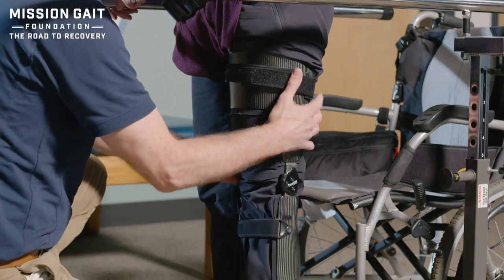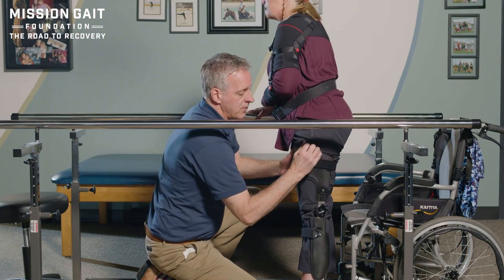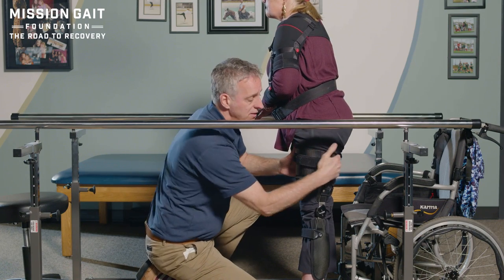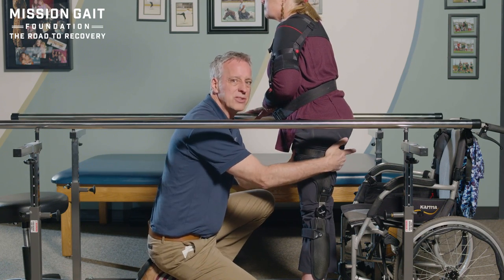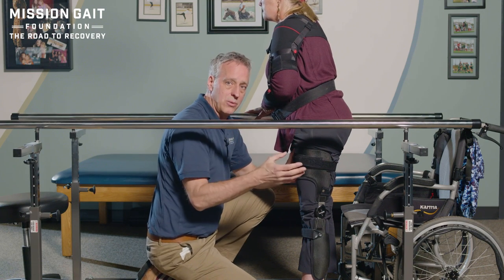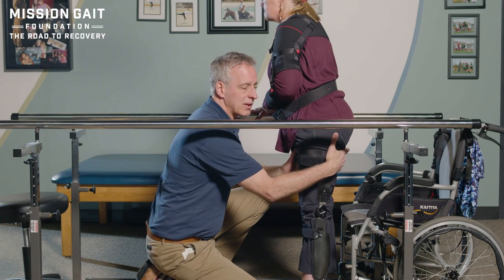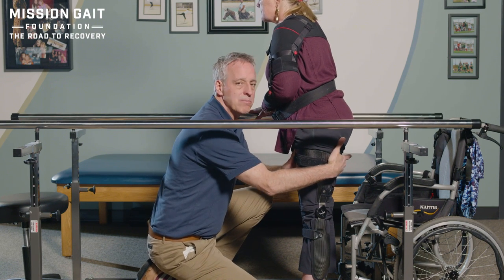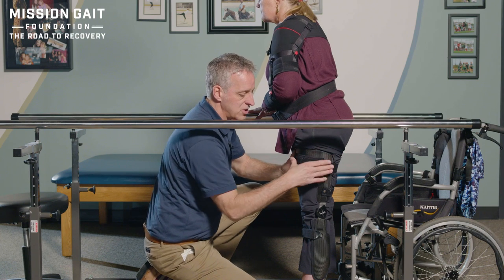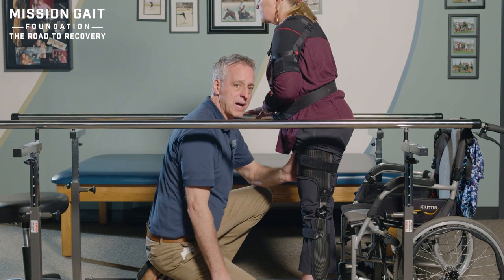I'm going to come back here to stabilize. Stand nice and tall, Eleanor. What she had some problem with early on is the very top of the brace was cutting into her and rubbing. They always want to make the brace a little too high to start with, because you can always cut it down but you can't put it back. So nothing wrong with the trim lines being a little high — they just need to be cut down a little bit so it doesn't pinch and cut into her. We also adjusted some of the straps specifically for her to help her be able to get it on a little bit better.